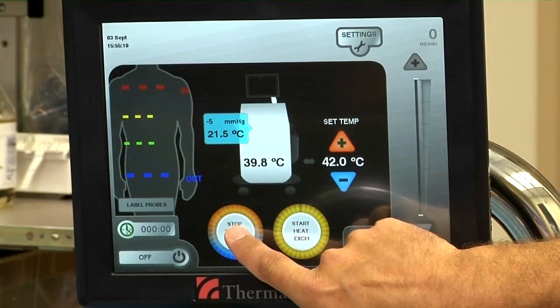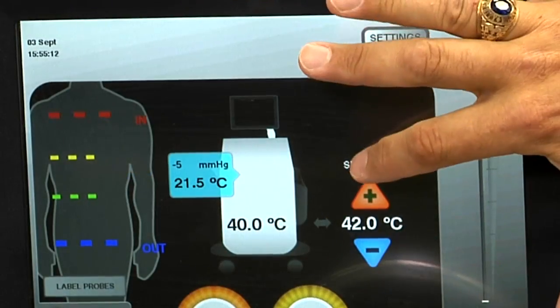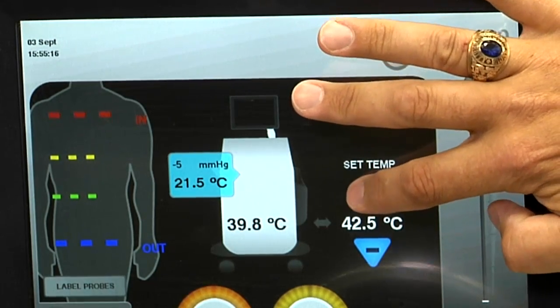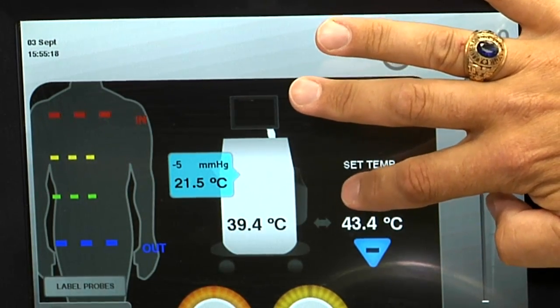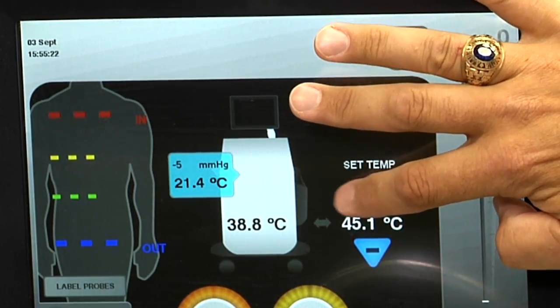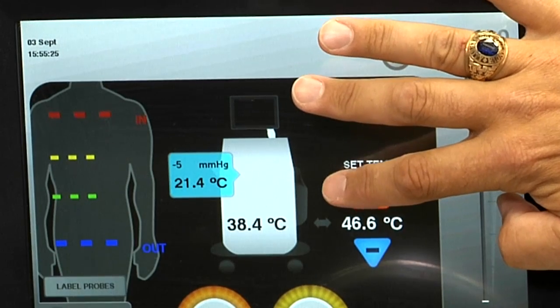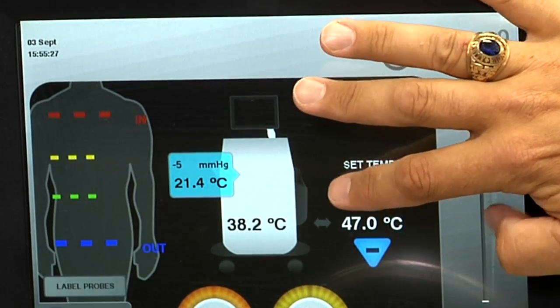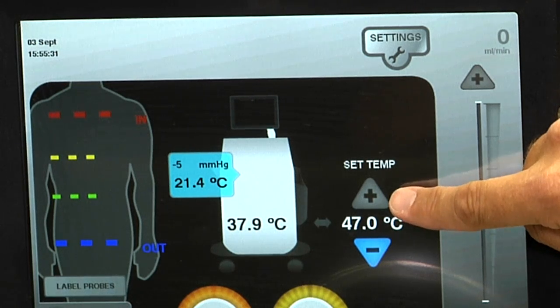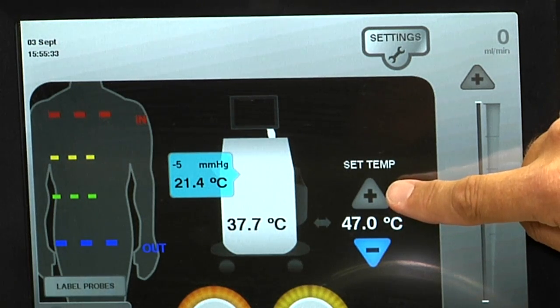The next step is to start the water bath and begin to preheat it. The temperature setting will get turned up to 46.5 or 47 degrees to preheat the water bath. When you've reached the maximum temperature of 47, the plus sign will be grayed out and you will not be able to increase any further.